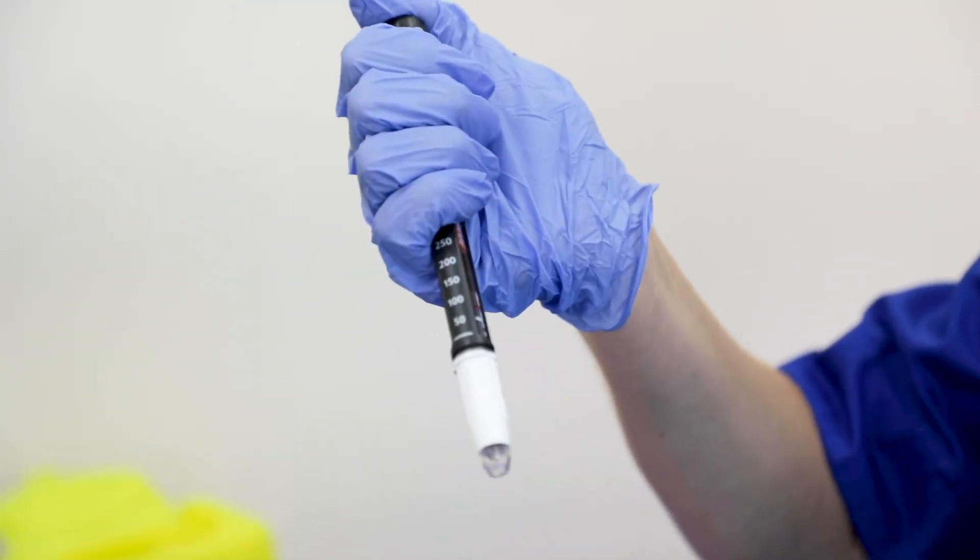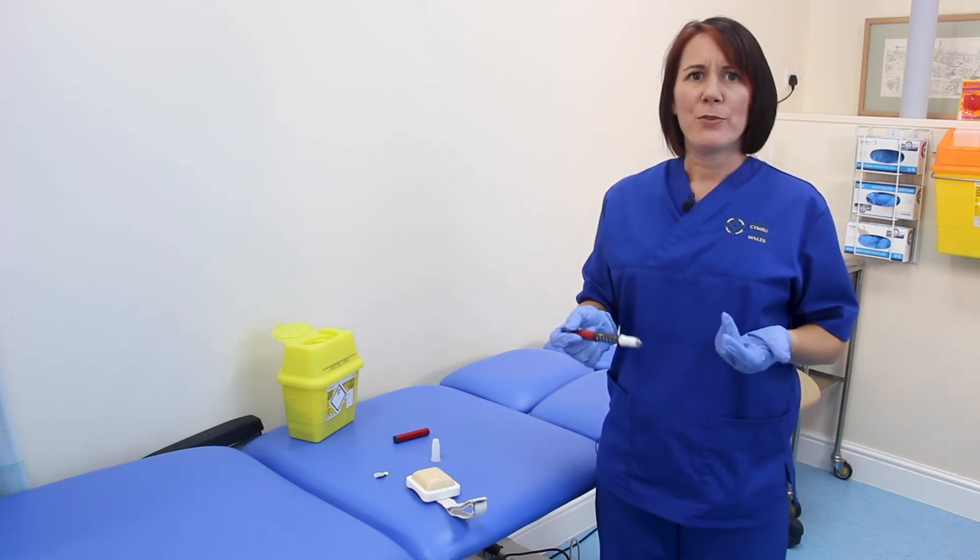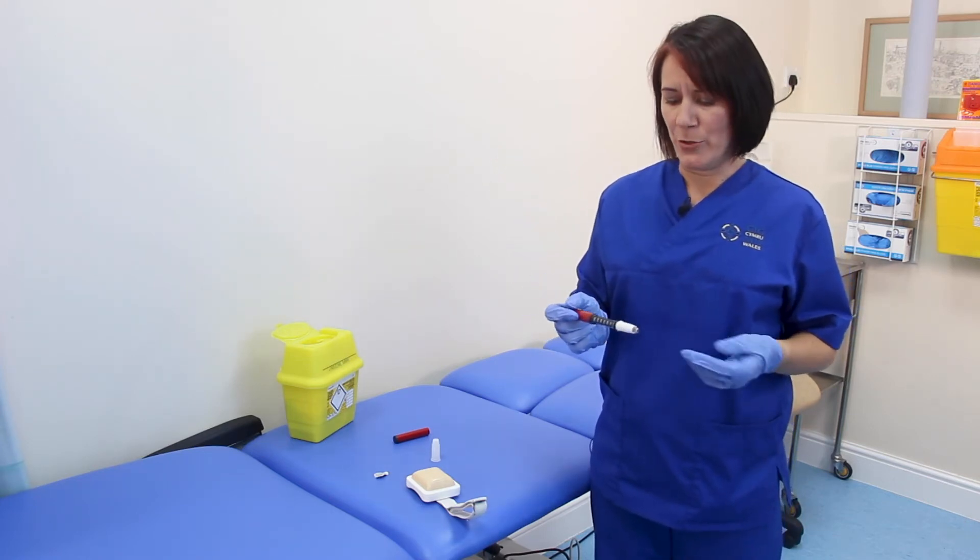Push your plunger and you should see drips coming out of the bottom of your pen. If you don't see drips coming out the first time, just repeat this process until you do.